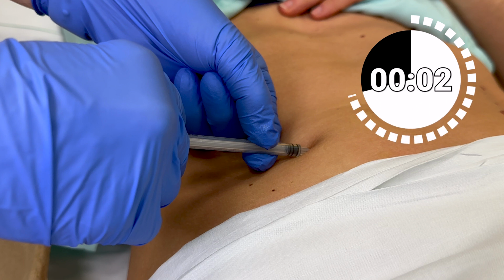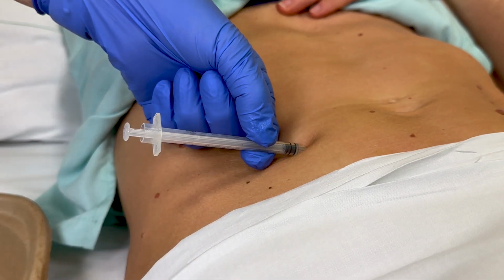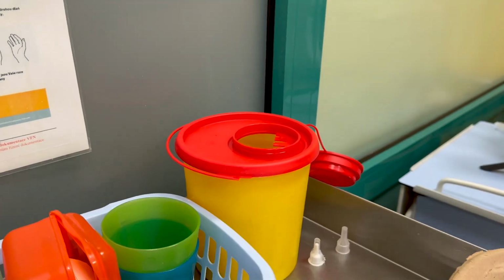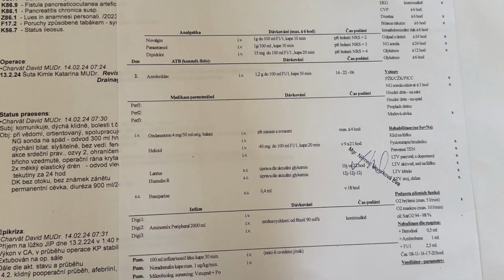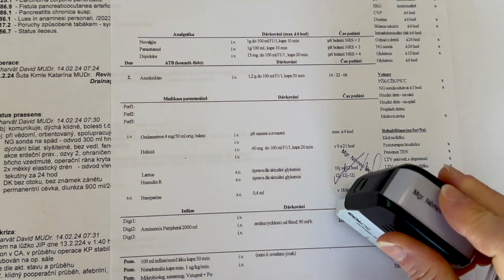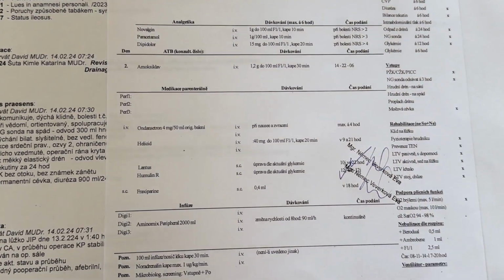After the injection, wait for 10 seconds. Place a gauze pad on the injection site. We remove the needle. Wipe the injection site with the gauze. We clean up the equipment and dispose of the insulin syringe in the sharp waste container. A record of the medication administration will be made in the medical documentation with full patient identification.